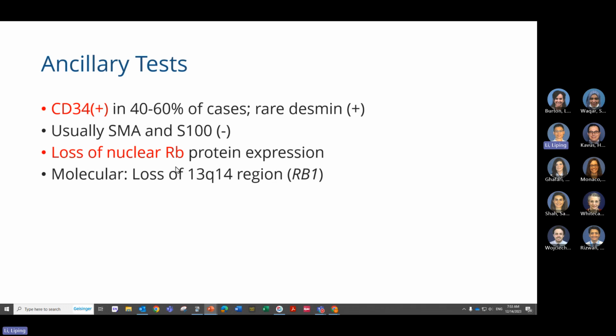Anyone have any idea? What do you think about the other 3 entities? I can tell you the location. One is from the breast. One is from soft tissue. One is from the acral site, that is the finger. Anyone can remember what kind of entity with this immunostaining feature?